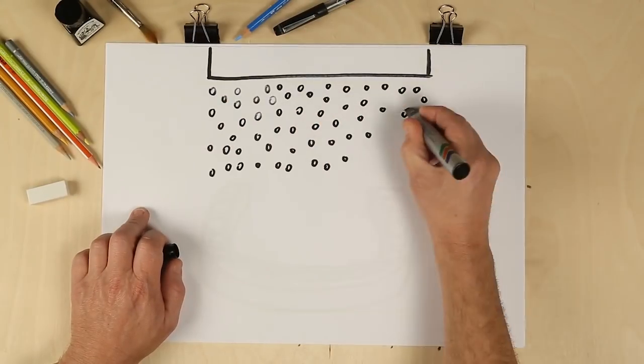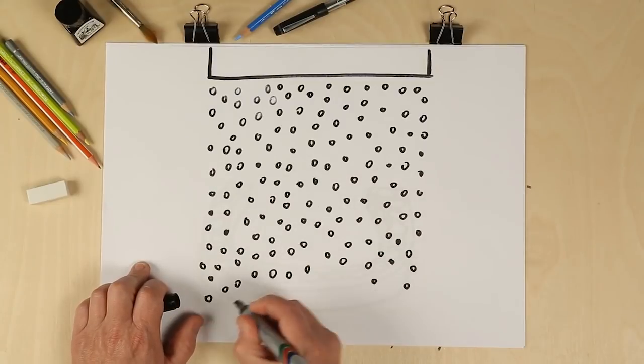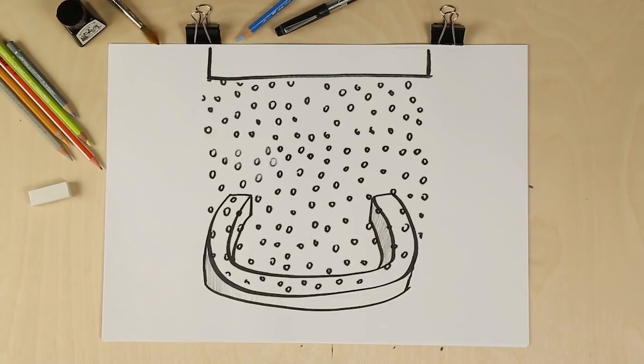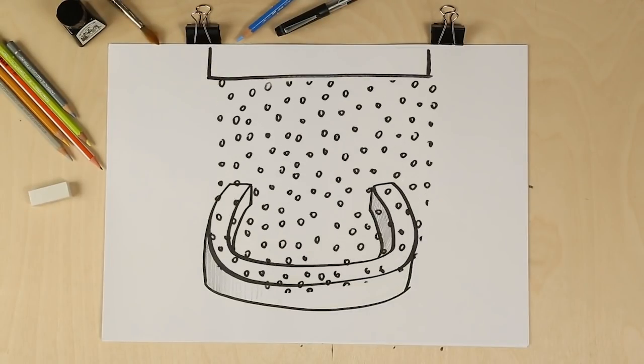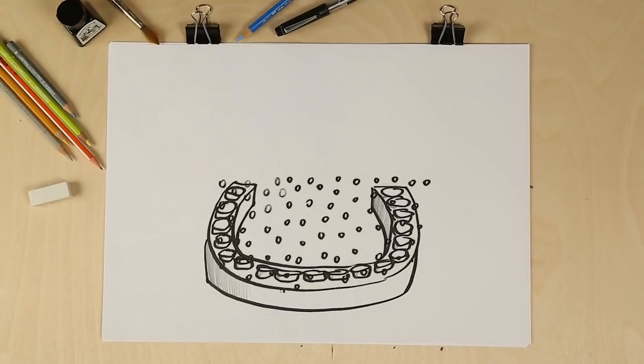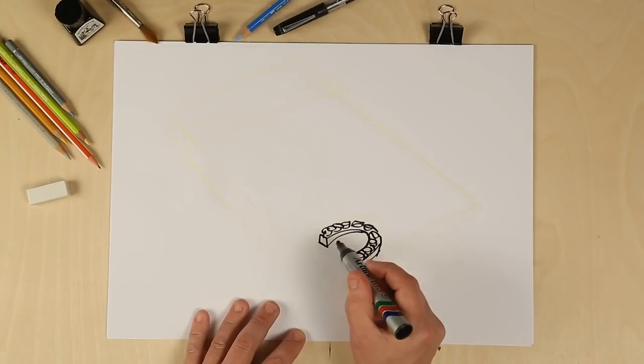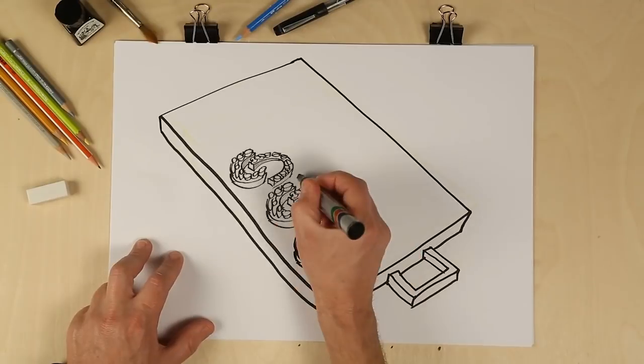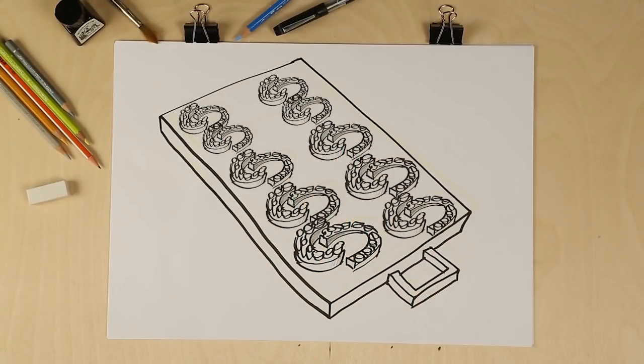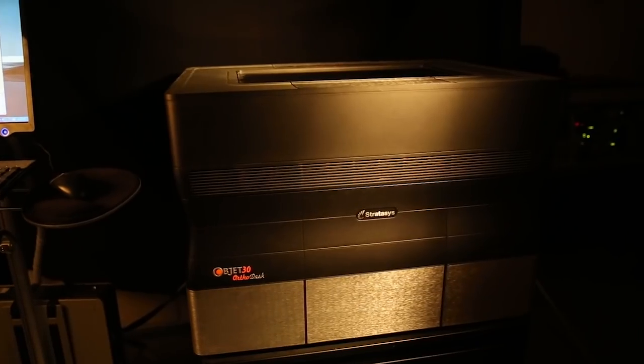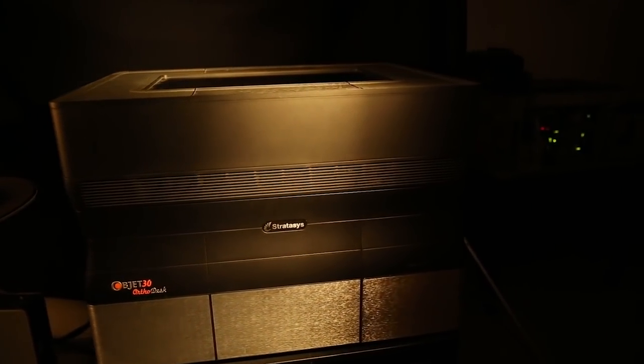It uses Object inkjet 3D printing technology to print ultra-fine layers of material for smooth, accurate models. And you can create as many as 20 models per print run. Just like larger, more expensive systems, Object 30 Ortho Desk gives you the power of cutting-edge technology at a price you can afford.